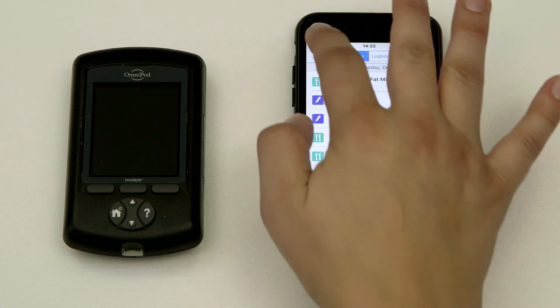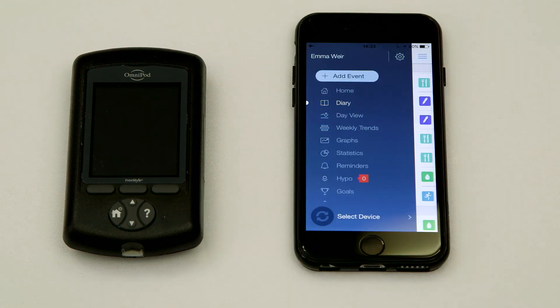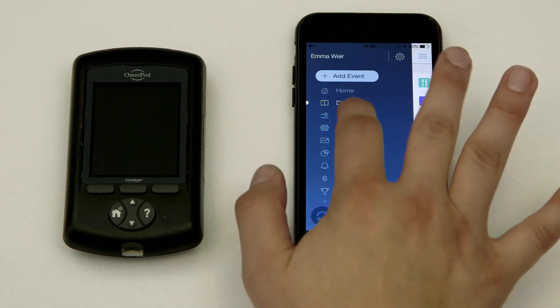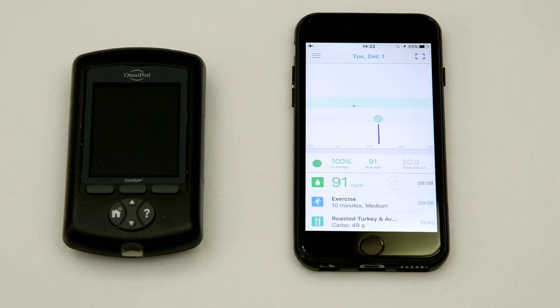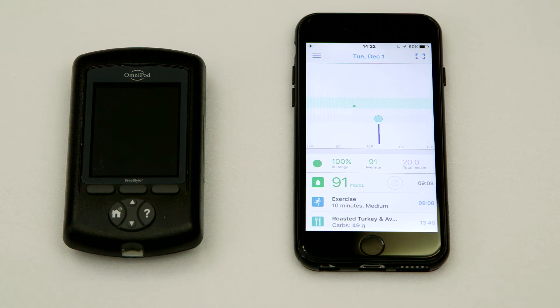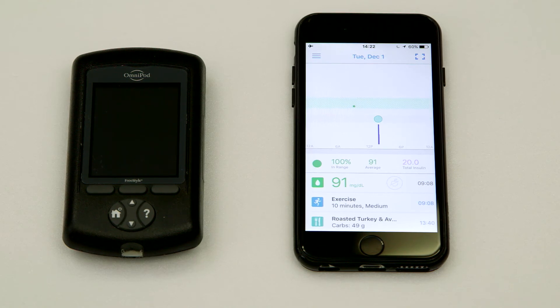Next, tap the side menu again and go to the day view. From here you can see your insulin and BG side-by-side for each day.